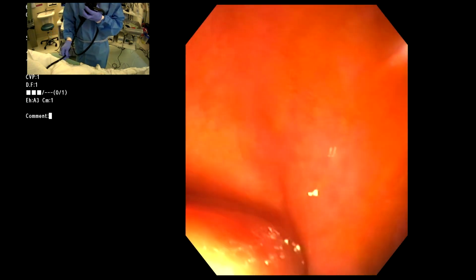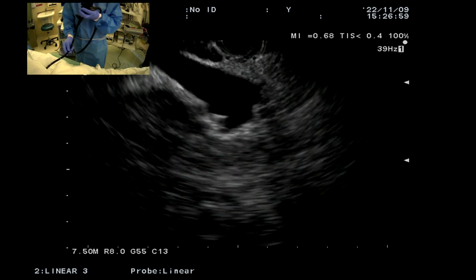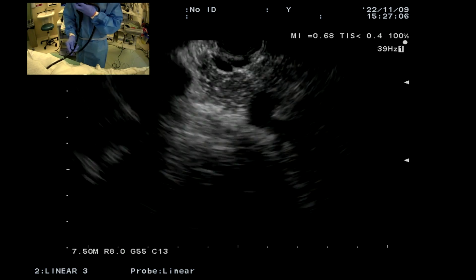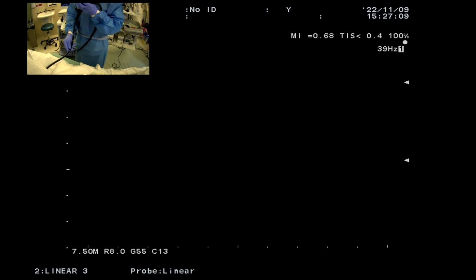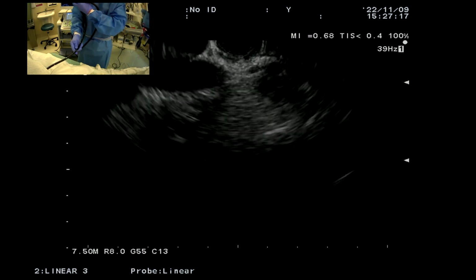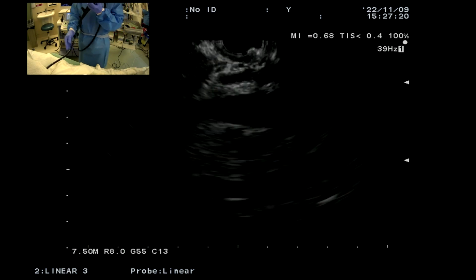I'm inserting the curved linear array echo endoscope now, sliding by the cardia into the stomach. We'll just do a quick survey of her hepatobiliary anatomy. Here's the portal. Let's go to EUS, please. I'm in the bulb. Just very quickly take a look from the bulb, and you can see we have really nice flow of the portal vein, the confluence here, superior mesenteric vein, superior mesenteric artery here. Pancreatic head looks normal. We can also see above that the bile duct, the cystic duct joining the bile duct right there and going towards the ampulla, going upstream here.